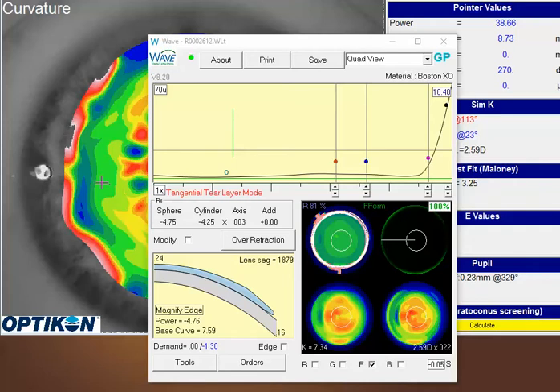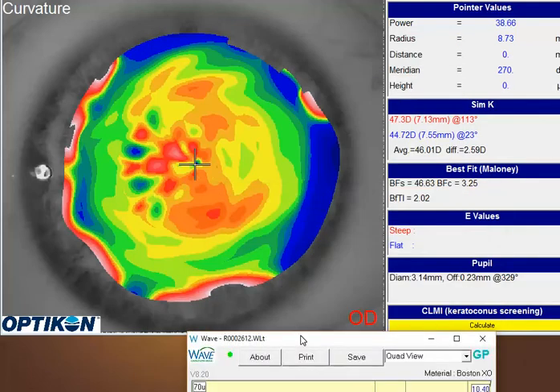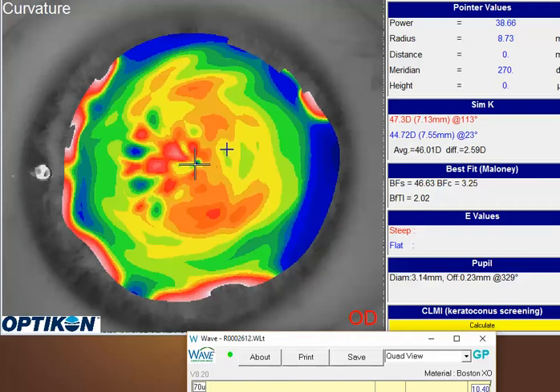One of the things I notice when I look at it — when we go back to the topography — the left topography is very nice and clean, very smooth contours. This right one you see quite a bit of irregularity here centrally. That usually suggests the quality is a little bit off. Maybe the cornea is starting to dry out a little bit between blinks, but at any rate you've got some distortion here.